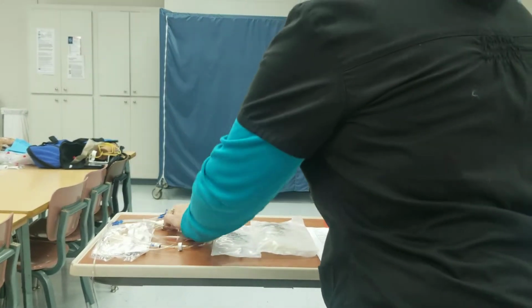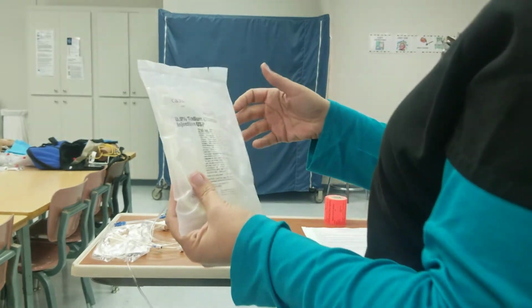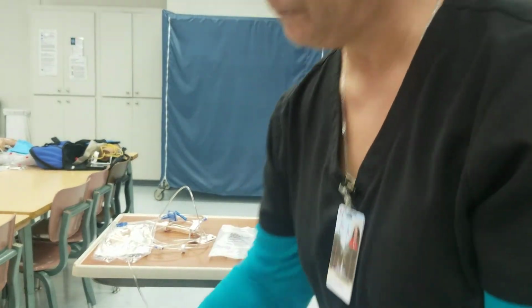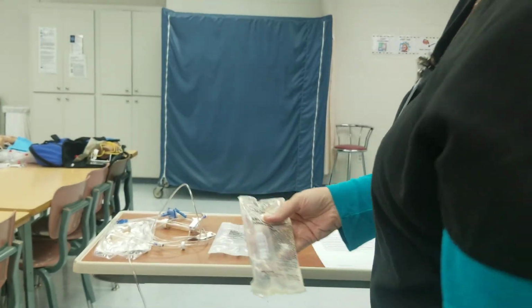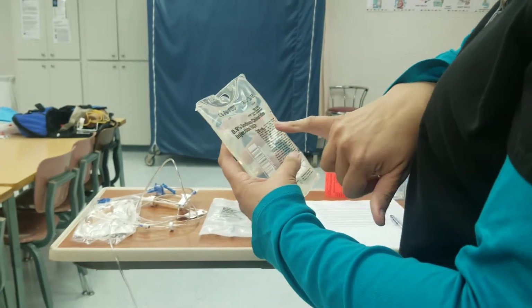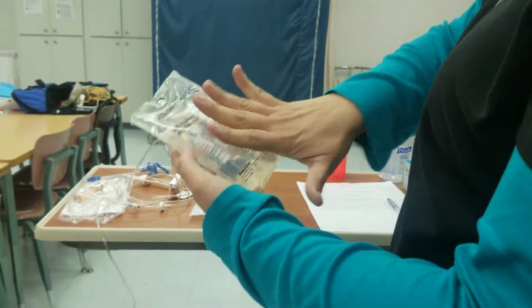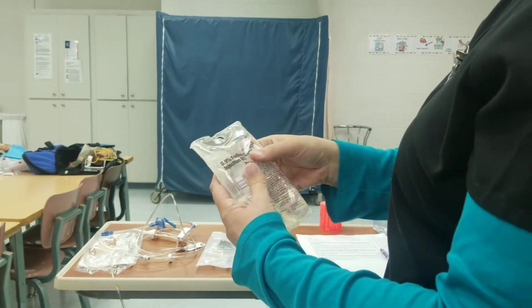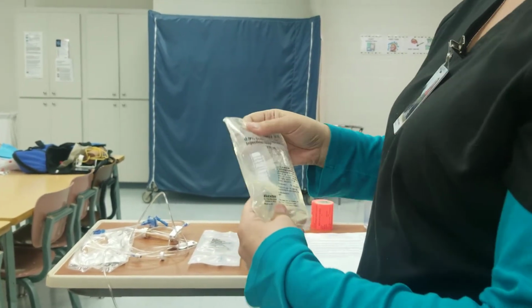We're going to take our large bag of normal saline. It has a tear right here. You just pull it down the side. Whenever you've got your bags, you want to look for clarity. Make sure that it's not expired. So these bags are expired, but when you're actually working in a nursing home or a hospital, they won't be. If it is, you need to get another bag.